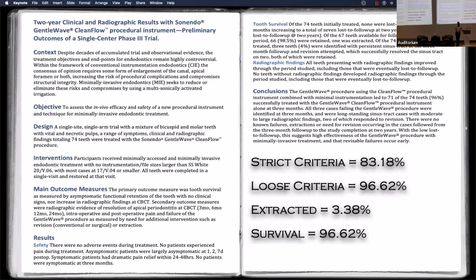So I'm using patency files when I think something might be going sideways, but I'm going to use a rotary patency file first because it's right there. And that's actually what I want, that rotary patency path, hence starting with the 10 hand file, then the 1002, which is about the same size, it's a little bigger, and then the 15 and 20. And those are taken to patency as well. So I'm not instrumenting short. I'm not doing any kind of step back with those files like we used to do. They're all going to length because they're so small.